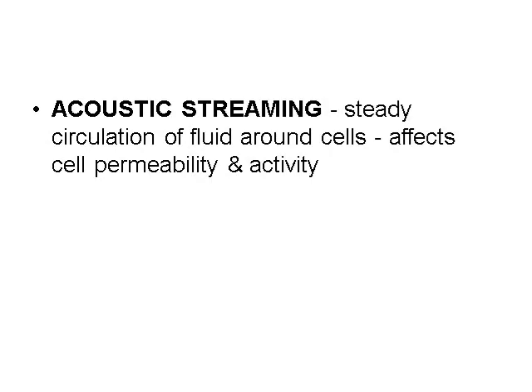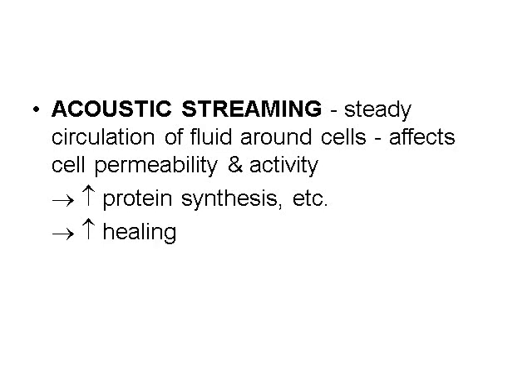A further non-thermal effect is acoustic streaming. This describes the setting up of local fluid circulation around cells, which has been reported to alter cell membrane permeability and cell activity. Acoustic streaming has been reported to be responsible for increased protein synthesis and other cell activities, thereby aiding the healing process, particularly in the inflammatory and proliferative phase.